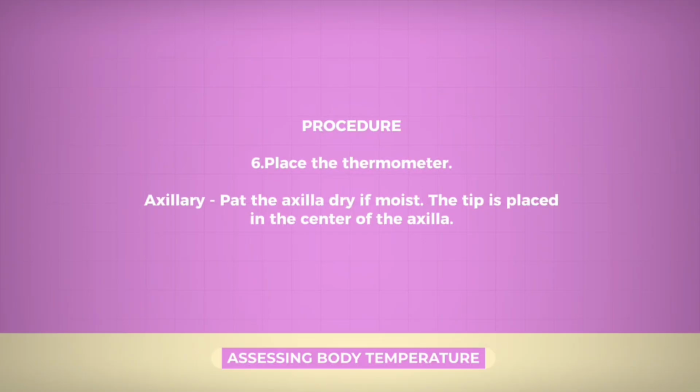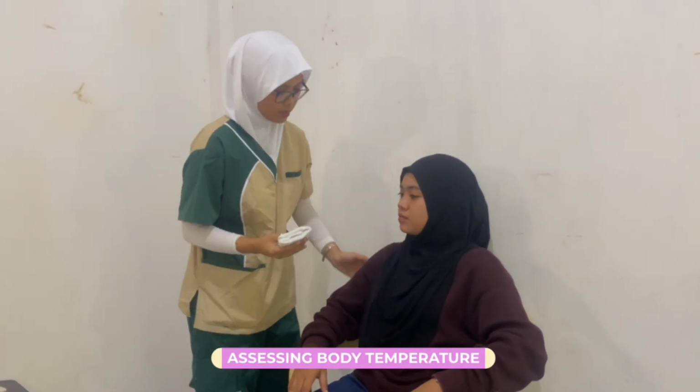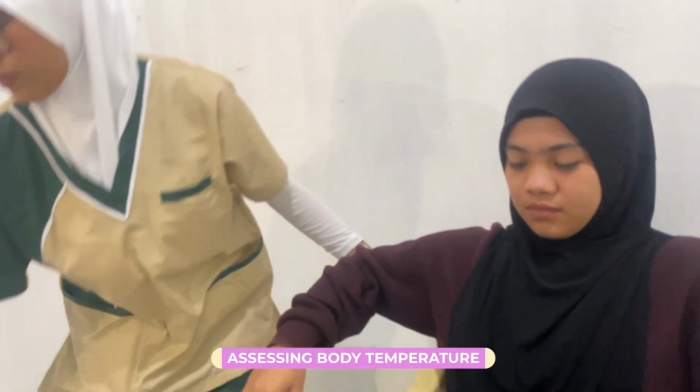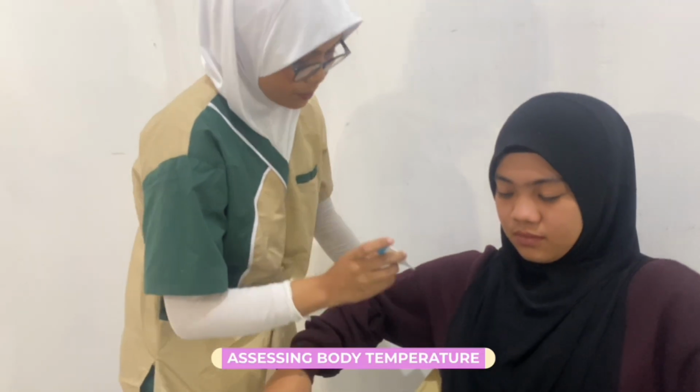For privacy purposes in this video, we will place the thermometer under the axilla with the shirt on, but in a real clinical setting, the tip of the thermometer must be placed under the axilla and at the skin of the axilla. So, ma'am, I will pat your axilla. And now I will insert the tip of the thermometer.